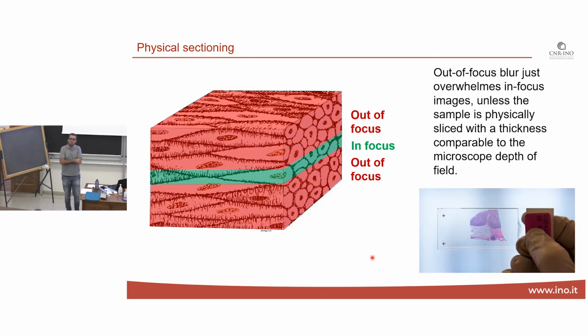And we are seeing that, for example, in some cases, if you have a tumor, even if you have a two-dimensional slice, the tumor is so evident, so apparent, that the diagnosis is simple. In other cases, we are working with physicians who would like to look at the sample in a more three-dimensional way, so that, for example, on edge cases where it's not clear if there's a tumor or not, by looking at the three-dimensional sample instead of a small slice, they should get a better diagnosis. So we are trying to bring this technology also to the clinical field. We're trying to see if there's margin for that.